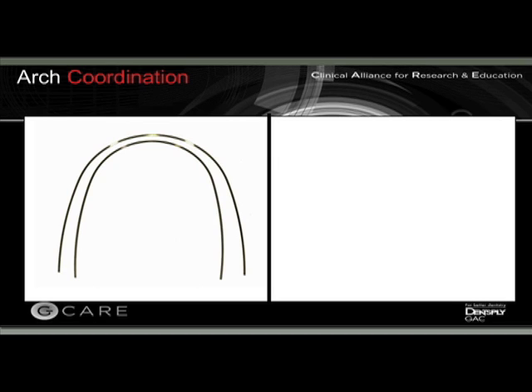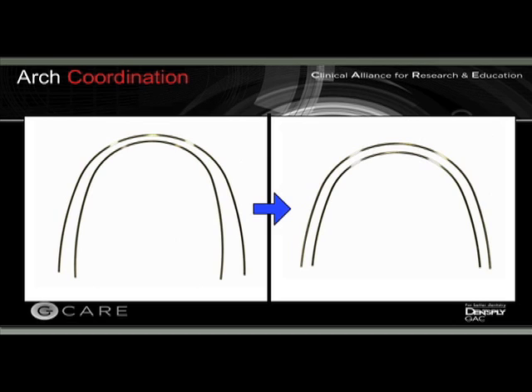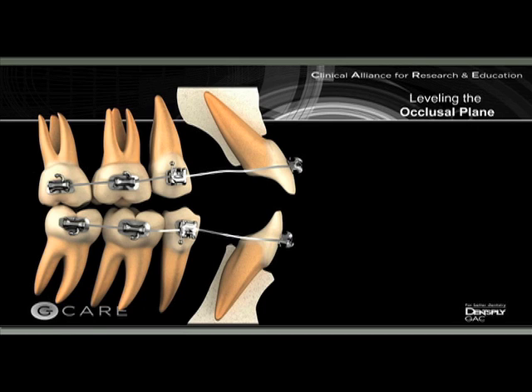You can see here two wires, upper and lower, taken out of the box. They're not coordinated, so the idea is just to coordinate them so the lower wire will be under the upper 2 to 3 millimeters, as you can see in this situation. So every arch wire has to be coordinated.